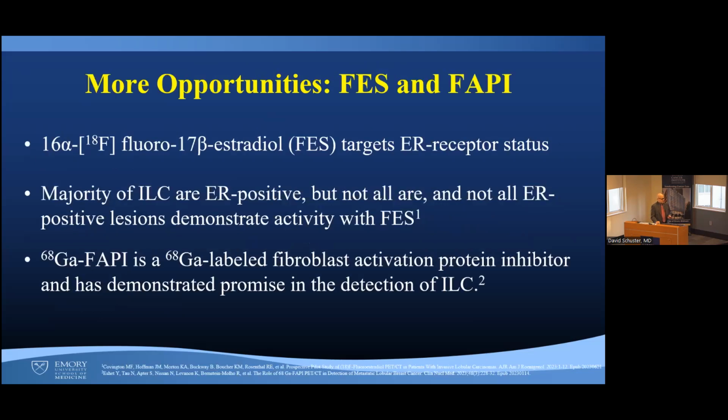There are more opportunities here. So now we have a radiotracer called FES, or fluoroestradiol. It targets ER receptor status, and it's called Cerianna. And we've been using this clinically.